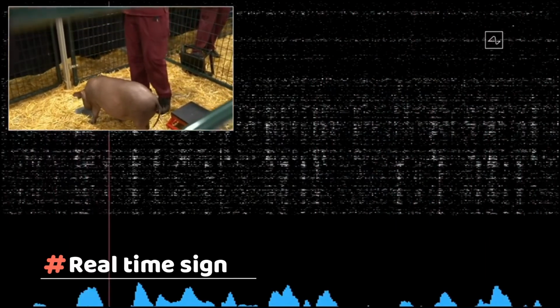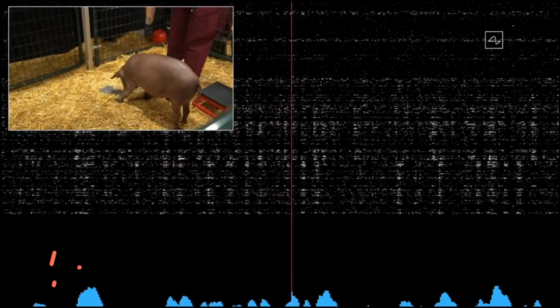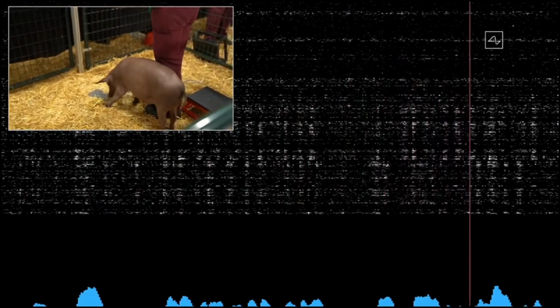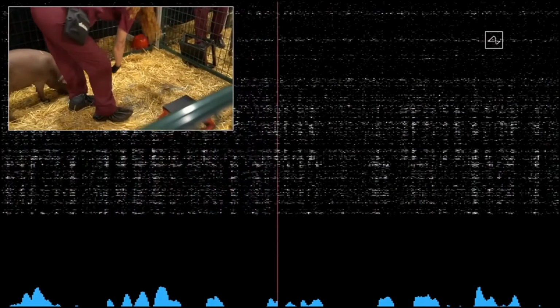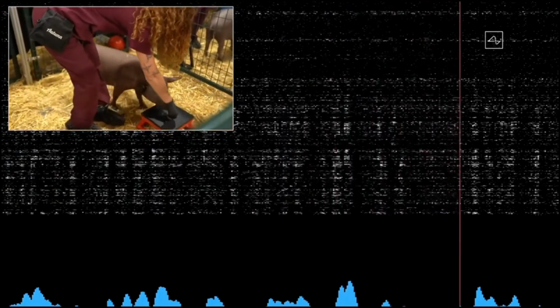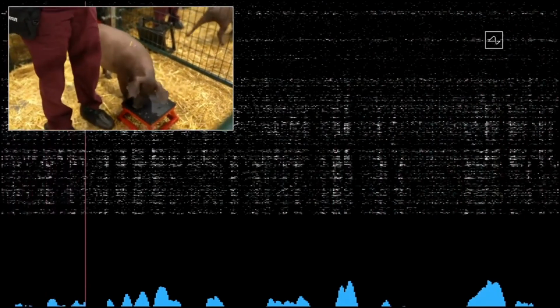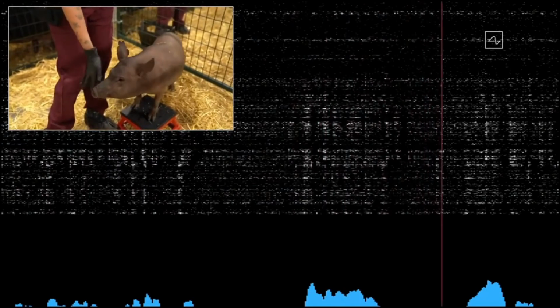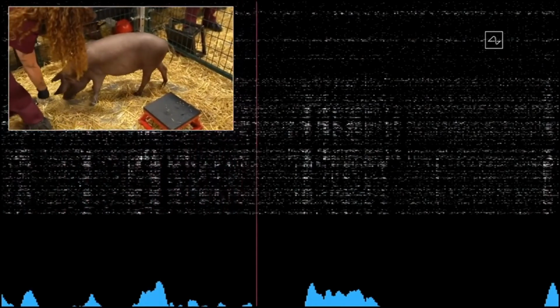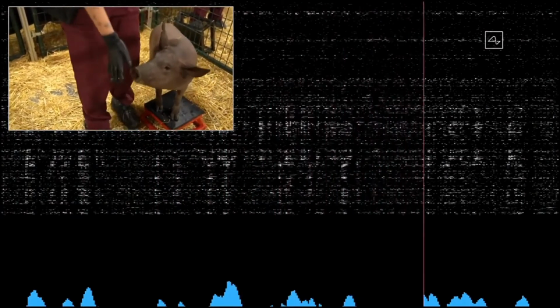So what the beeps you're hearing are real-time signals from the Neuralink in Gertrude's head. This Neuralink connects to neurons that are in her snout. Whenever she snuffles around and touches something with her snout, that sends out neural spikes, which are detected here. On the screen, you can see each of the spikes from the 1,024 electrodes. If she snuffles around, touches her snout to the ground, or you feed her some food, pigs love food, then you can see the neurons will fire much more than when you're not touching the snout, and that's what's making the beeping sound.